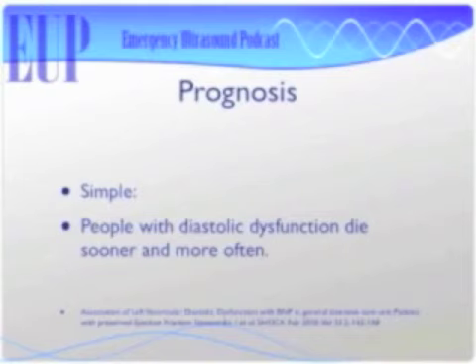So this is taking preload a whole step further, past IVC, past CVP, and it's basically, in essence, giving you an ultrasound pulmonary artery catheter measurement. Okay. Yeah, so I was planning on just tuning you out the rest of this, but that actually sounds pretty useful. So let's do it. Let's talk about some diastology.